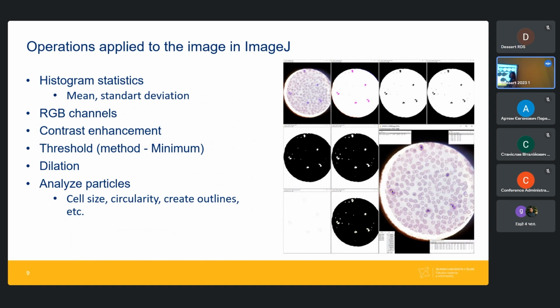What do you mean by group together? If these are calculated at pixel level, and then we saw a nice contour at the end. It also creates a CSV file with both the x and y coordinates for every point.